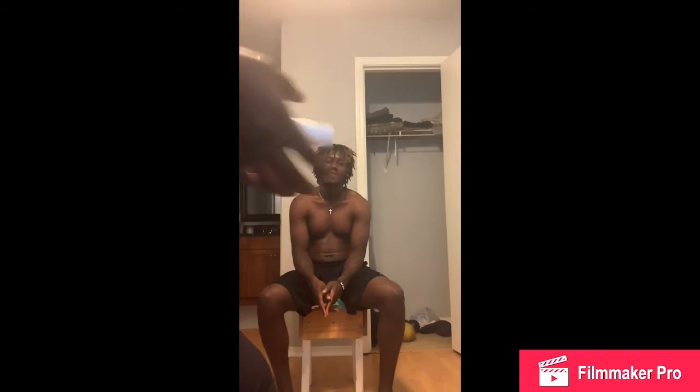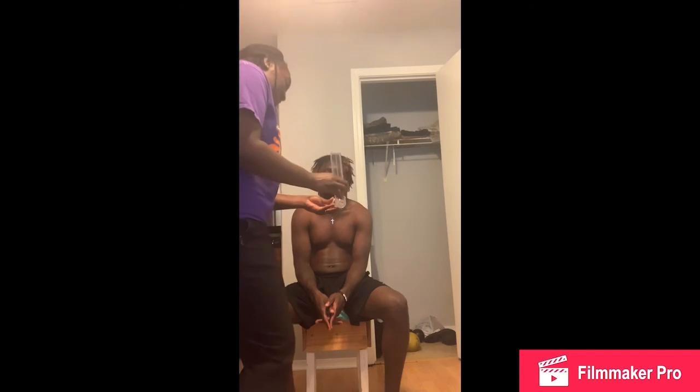Alright, so today we're going to start with your peak flow meter. This is the peak flow meter. This is used to test your lung strength and see how well your lungs work. So it usually goes off your age, height, and weight, okay? So basically it goes from red, yellow, green, but this one's red. So it's going to start at the bottom, as you see. It's a little thing right here.